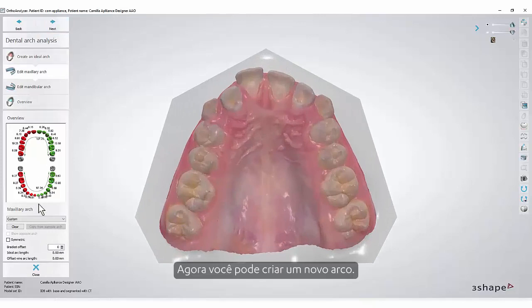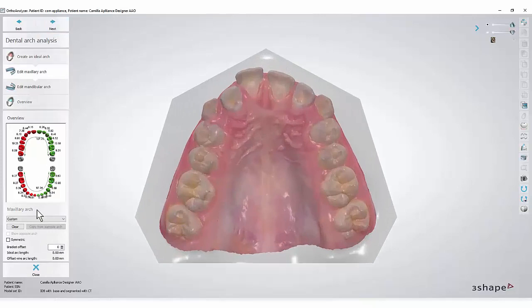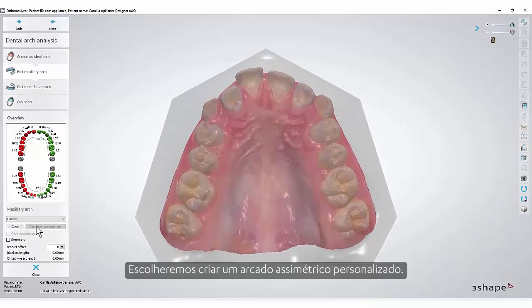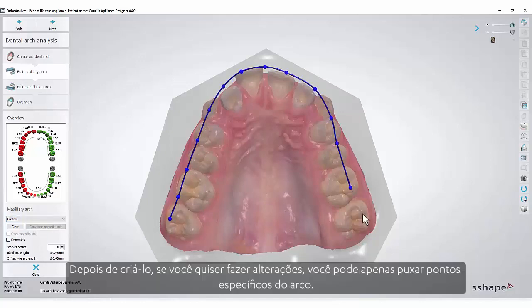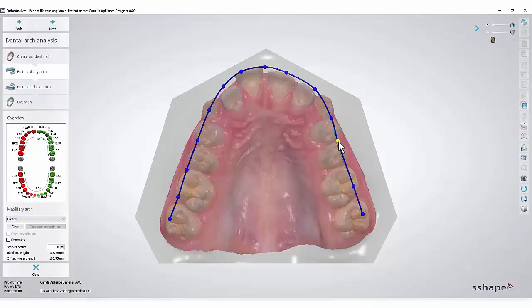Now you can create a new arch. We will choose to make a custom, not symmetric arch. After creating it, if you wish to make alterations you can just pull the specific points of the arch.